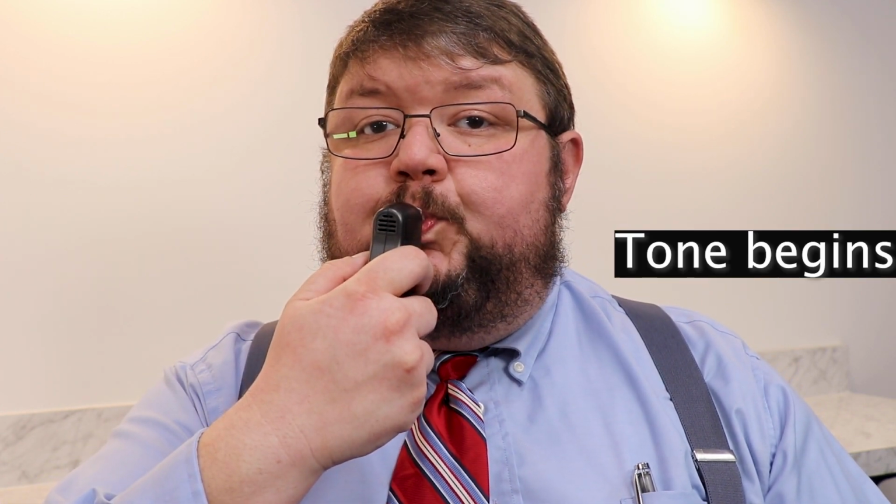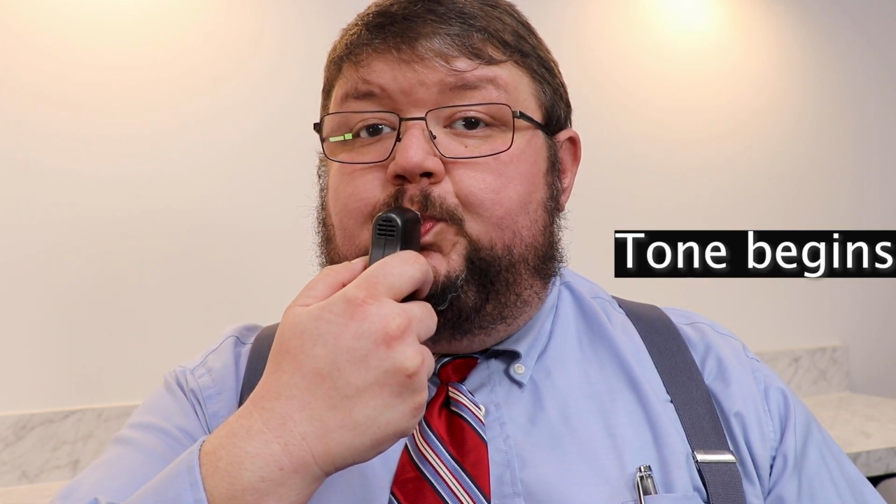See? I didn't blow long enough for it. So we're going to redo it. And what you're looking for is a slow, continuous breath. All I'm trying to do is maintain the tone. That's it. As long as you can hear the tone, and you'll hear a click when it's ready. Here we go. We're going to try this again. You heard the click? There you go.